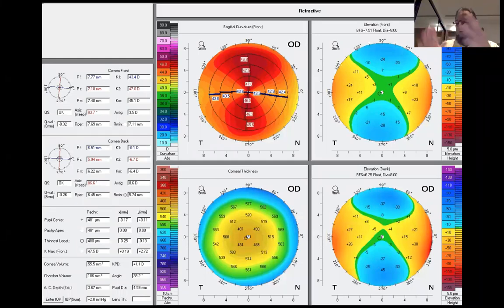For example, if the cornea was 500 before the operation, do you leave a safety margin of 400 microns, including the epithelium, or you may go beyond? Do you mean less than 400, Dr. Mazen? Yes. After the operation, what is the least thickness you leave?